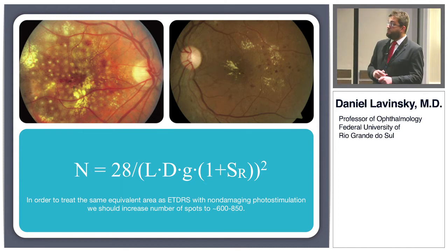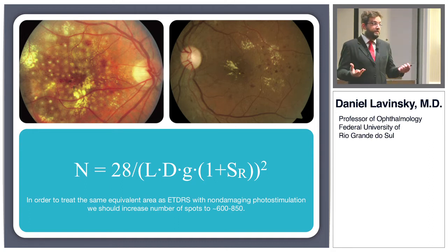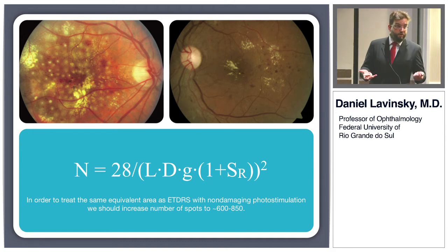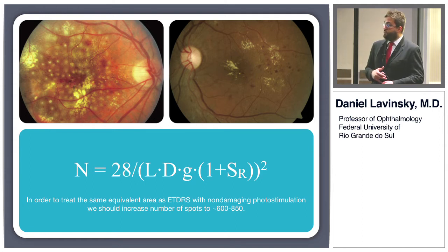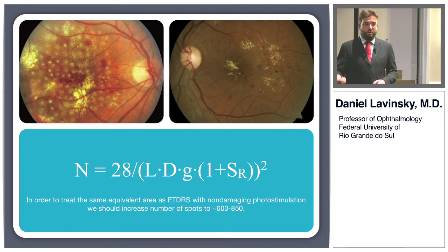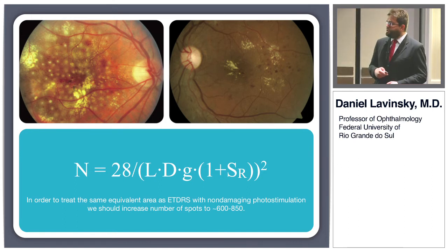But if you want to apply a treatment that mimics the gold standard, which is the best evidence we have even today for grid macular treatments, we should use the same formula and treat with a larger number of spots and closer to each other.